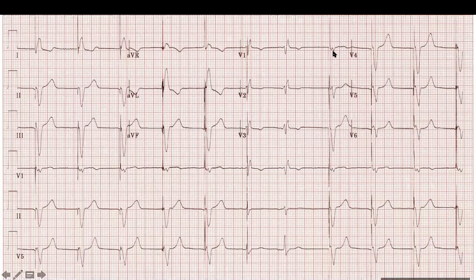Okay. So the type of pacemaker now, is it VVI or DDD? Because there is no atrial activity. Is it AFib with VVI? So we're still working on that. We haven't reached that yet. Okay. The answer. Thank you. You're welcome.